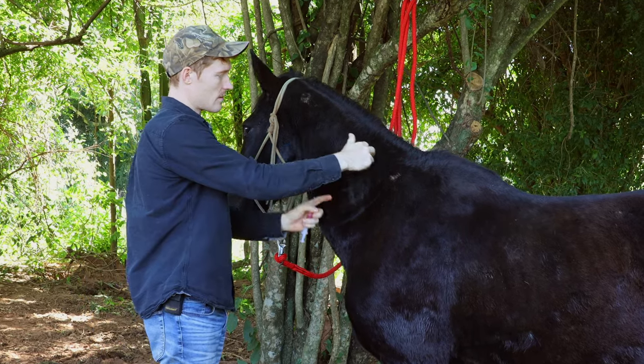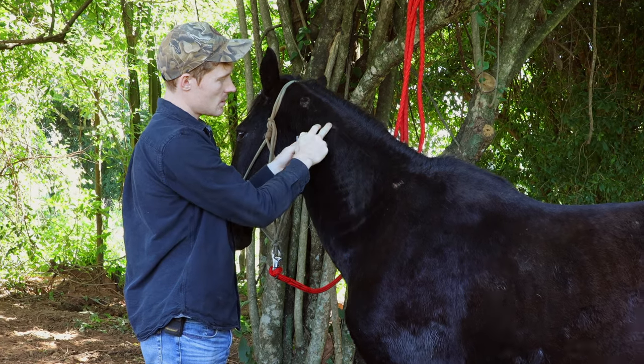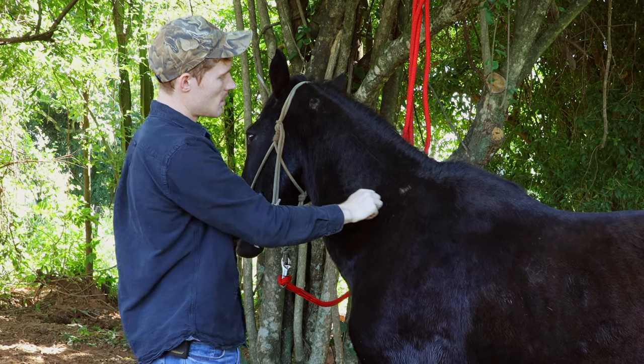Again, the triangle right here on his neck, a little bit inside — we're going to draw a triangle, and then right here on the base of that triangle, kind of in the middle of it, is going to be the best spot.